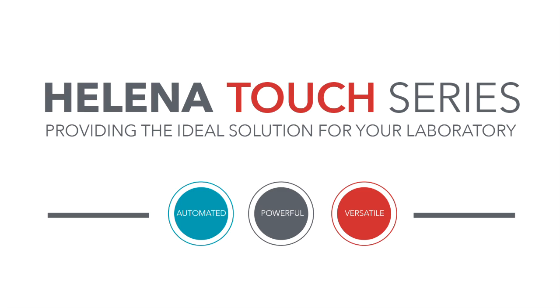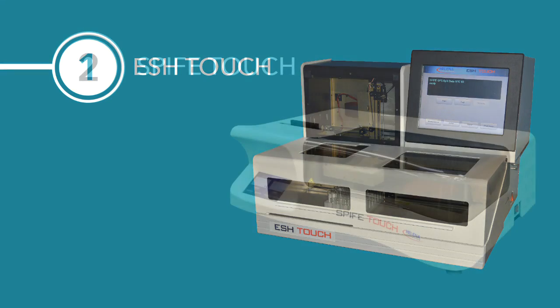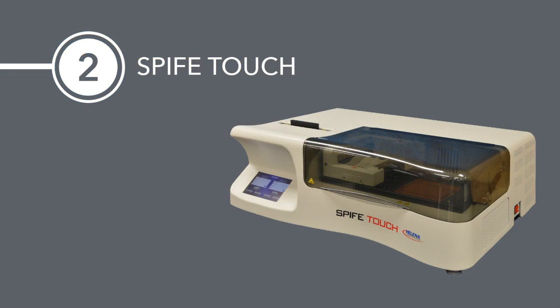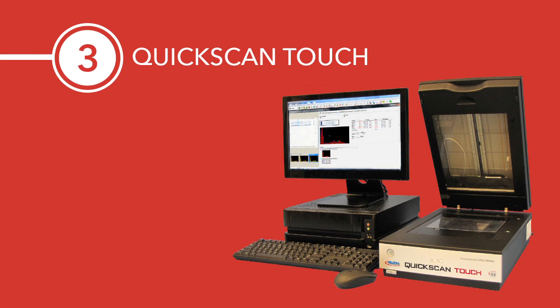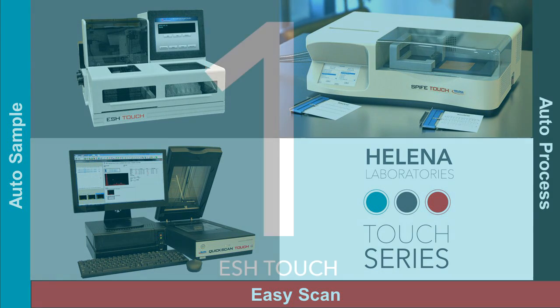Welcome to the next generation of the SPIFE family of electrophoresis analyzers: the Touch Series. The ESH Touch sample handler, the SPIFE Touch electrophoresis system, and the QuickScan Touch densitometer integrate to provide a very versatile workhorse solution suitable for all size laboratories.